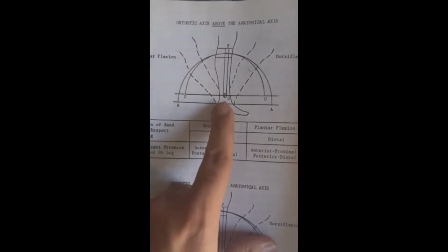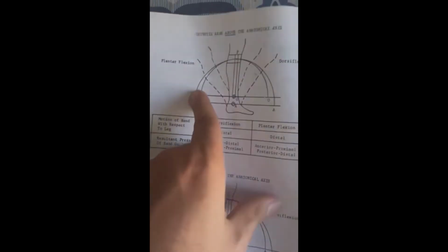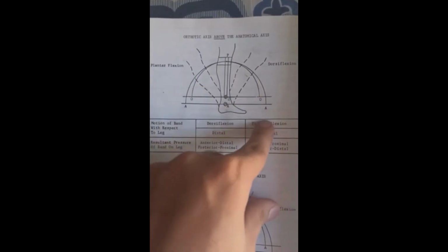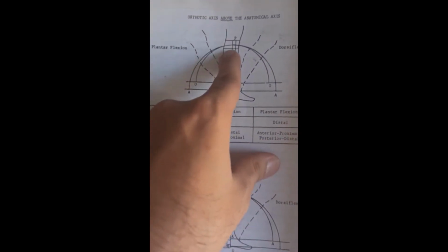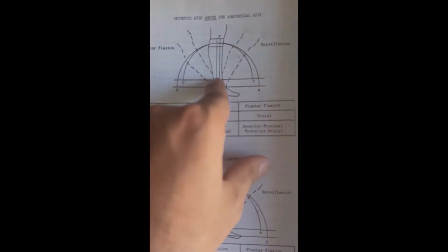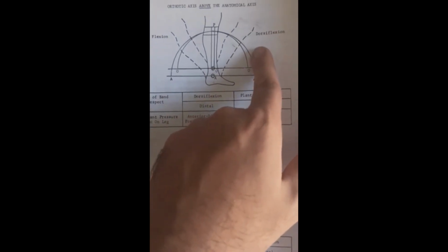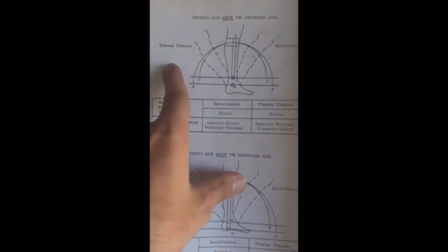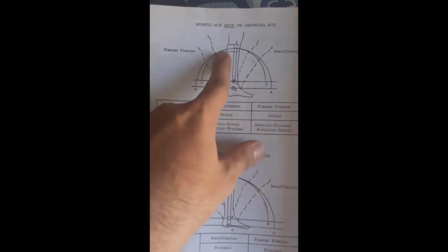The A denotes the anatomical joint, O is the orthotic joint, the arc of O is the motion of the orthotic joint, and the arc of A is the motion of the anatomical ankle joint. P is an imaginary point on the calf band. The dotted lines in front show the motion of dorsiflexion, in which the foot is stationary and the leg is moving forward. Behind, you can see the dotted line of the leg, where the foot is stationary and the leg is moving backward.